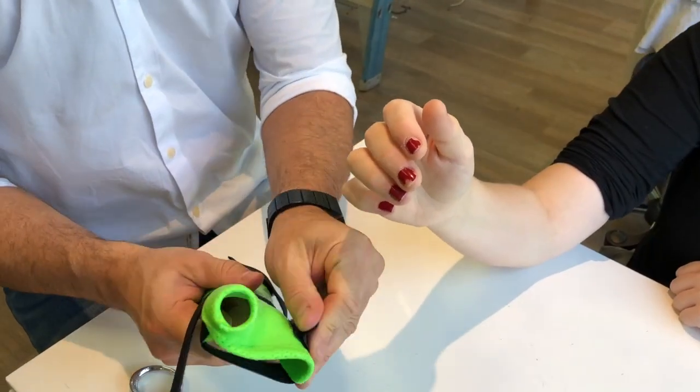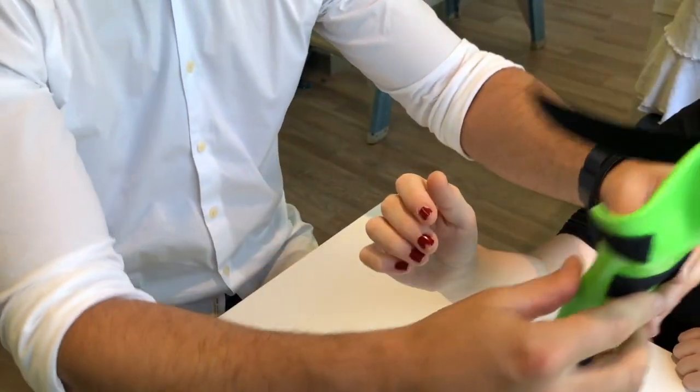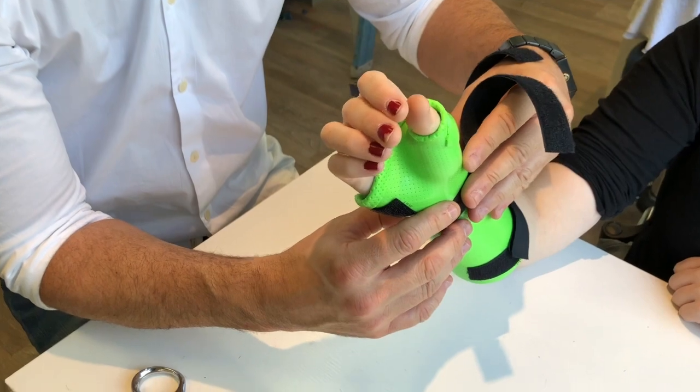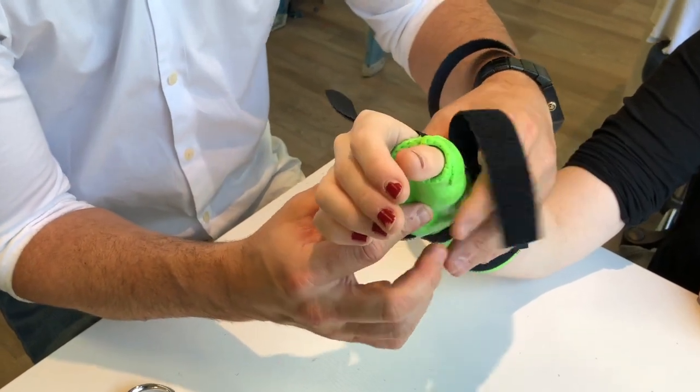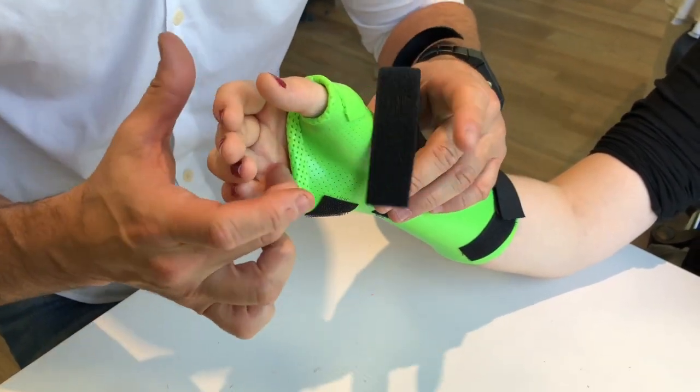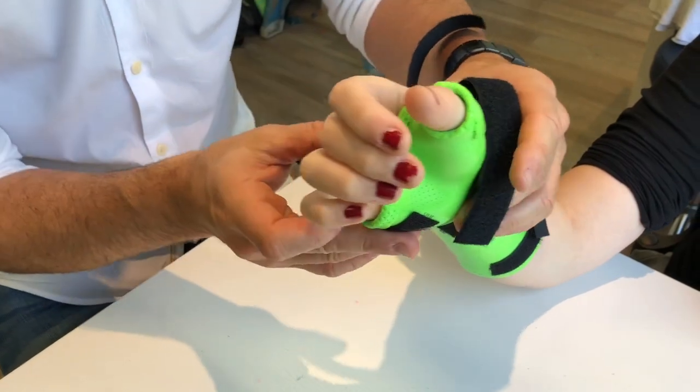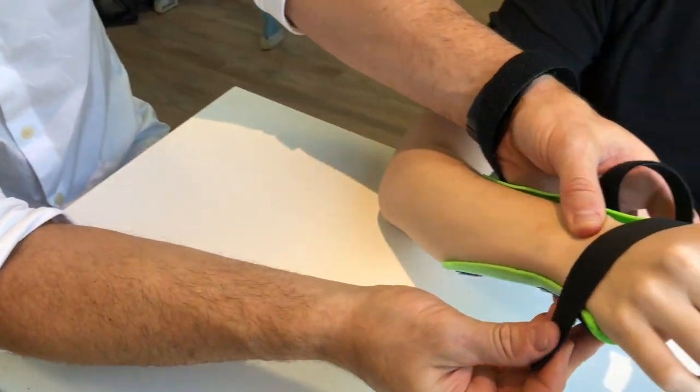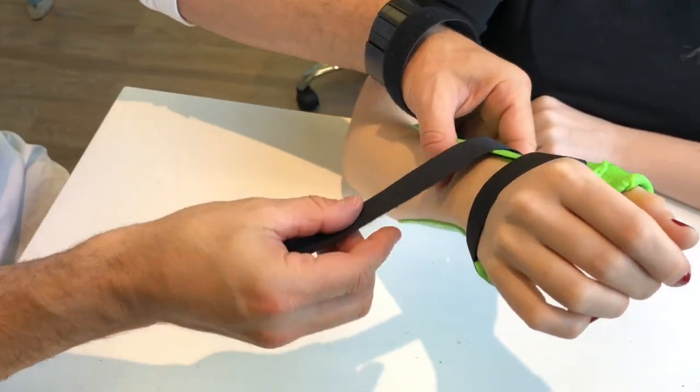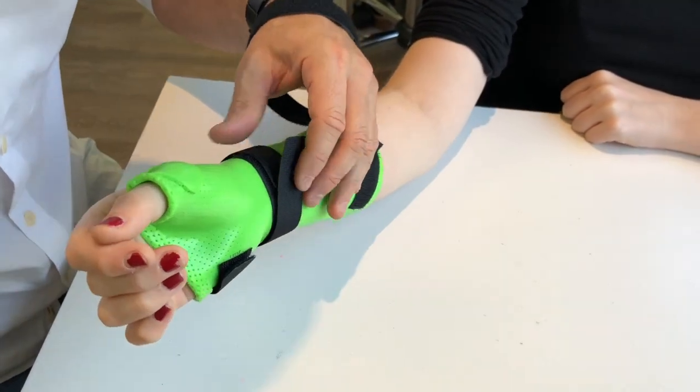Just doing our final fitting on the patient. Thumb in first. Should still be fitting well, pressing it against the hand. Making sure that it's sitting down in the distal palmar crease. We want it to be proximal so that our patient can bend their fingers. Our distal strap. We can see it's contouring nicely. Our wrist strap also contouring nicely. Just need to cut a bit of the length down.